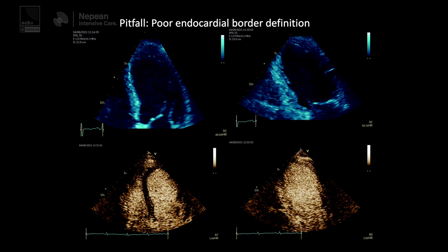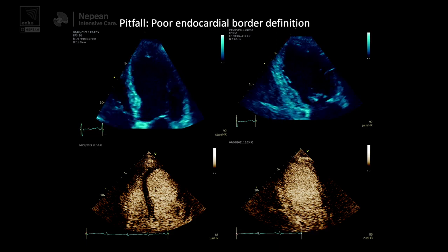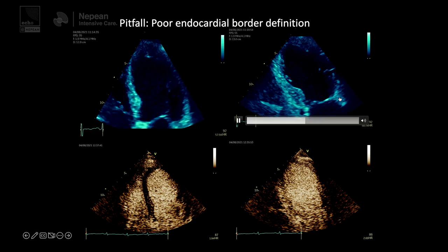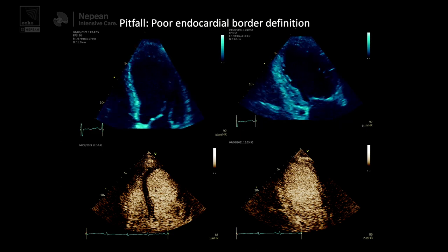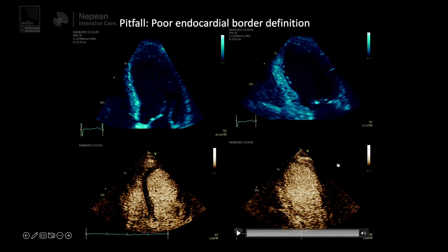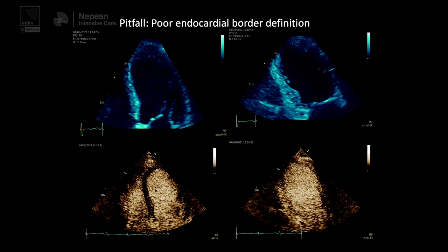That's sometimes good to try to see whether you can make that endocardial border definition clearer — and differentiating between trabeculations and the septal walls is another nice thing. We were a bit worried about their left ventricular systolic function. You can see the four chamber — I couldn't see the anterolateral wall or the apex very well, and often the hardest wall to view is the anterior wall in the two chamber. You'd have to use an eye of faith to trace that out.